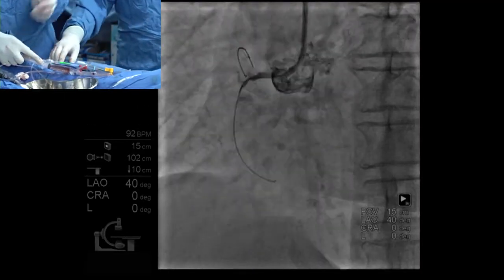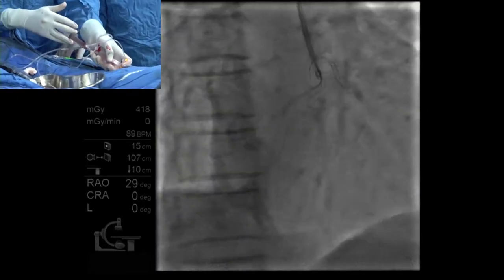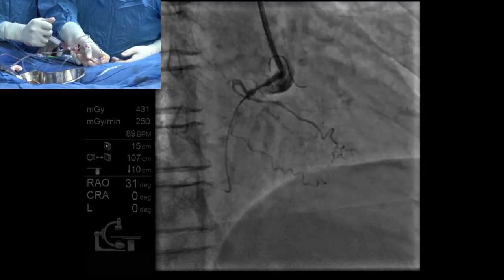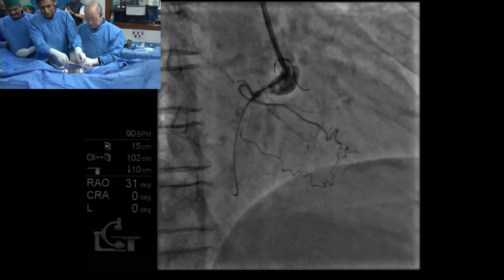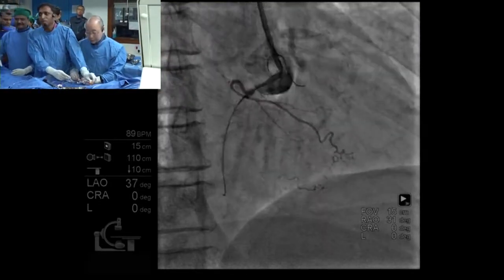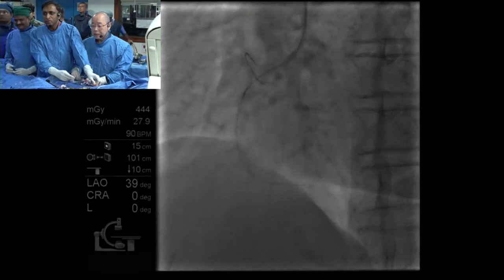It's good. RL. Yes, maybe good. Okay, LL. Dr. Saito, does the wire feel free? Yeah, feel free.